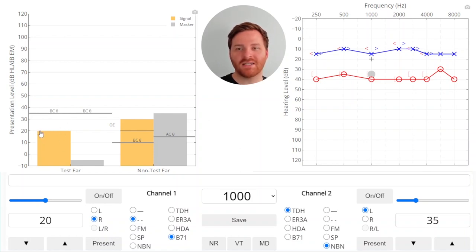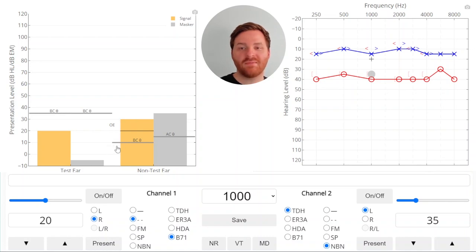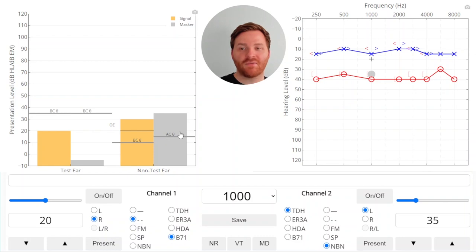Let's check out what's going on in the non-test ear. The 20 dB HL signal crosses over and doesn't lose any energy because it's transmitted by bone conduction. But the non-test ear is now plugged up with the masking transducer, so there's an occlusion effect that boosts this signal and makes it a little bit louder. So in the non-test ear by bone conduction, we have a 20 dB SL stimulus — the signal by bone conduction is 20 dB louder than the threshold of bone conduction in the non-test ear. The air conduction threshold is 15 dB, and the level of the masker is 35, which gives us also a 20 dB SL signal. At this point, we have a 20 dB SL masker covering up a 20 dB SL signal, for a signal-to-noise ratio of 0 dB. So the signal is just barely audible in the non-test ear.